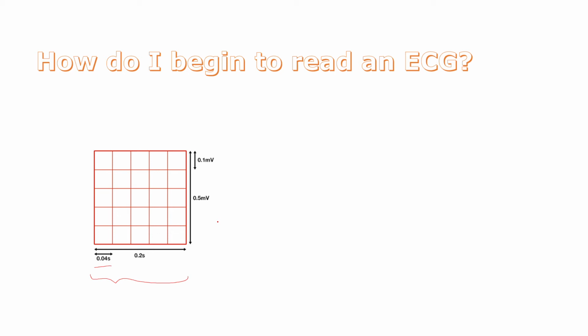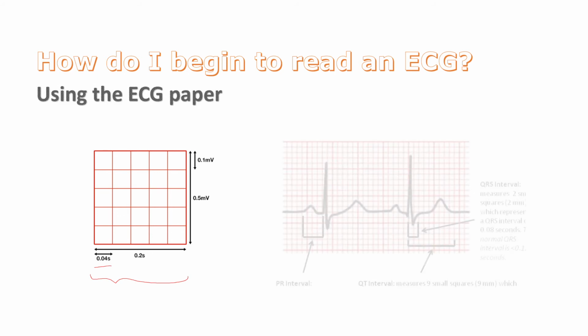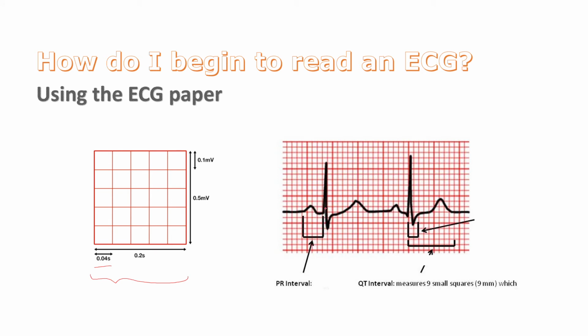Okay, so the measurement of important ECG intervals usually includes the PR interval, which is located here. I already described this. The QRS interval, which is located here, and the QT interval. So the QT interval also, doctors measure this.